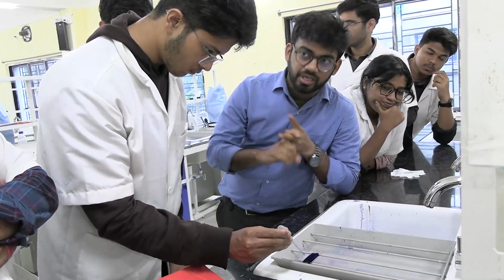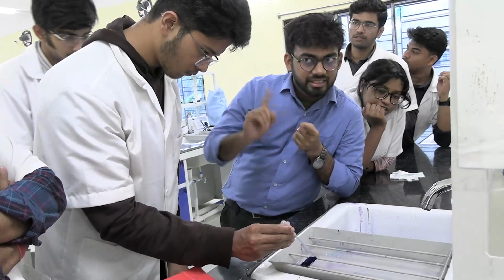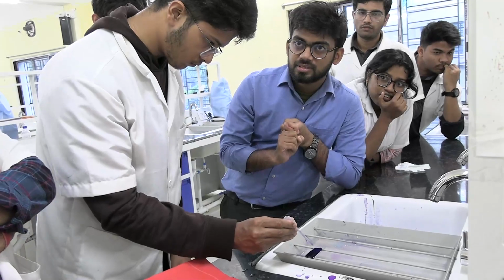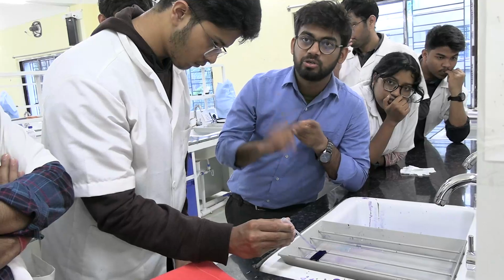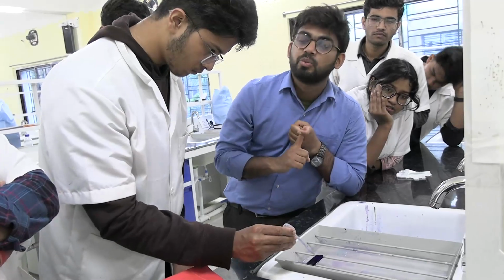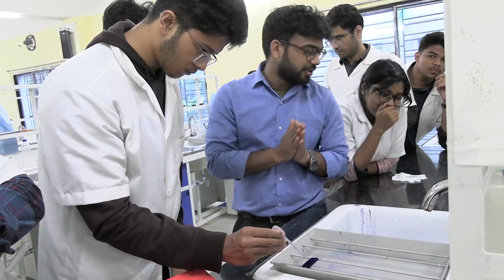Eosin. Eosin stains the basic granules, and methylene blue stains the acidic granules. So who is going to stain the nucleus, methylene blue or eosin? Methylene blue, because it is basic. It stains the acidic part, and the nucleus is acidic because of the presence of nucleic acid, deoxyribonucleic acid, DNA. Do you understand the basics?